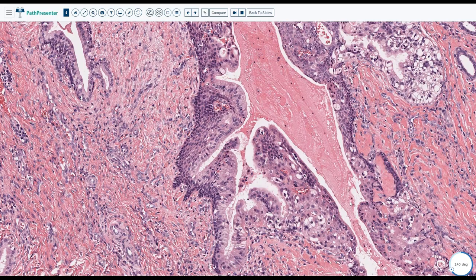And actually, in this case, it is minor salivary gland. But if it is a major salivary gland, like parotid gland, and I see a kind of squamoid area, most of the time it is metastatic squamous cell carcinoma. It is rarely primary squamous cell carcinoma. So this is the common scenario, and it is metastasizing in a lymph node, what we call intraparotid lymph nodes.